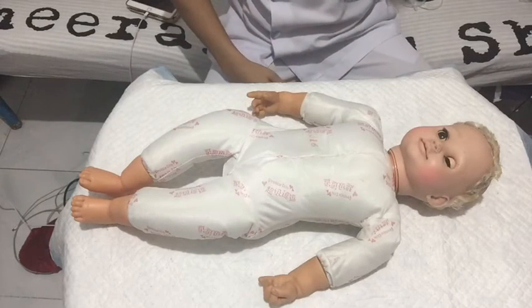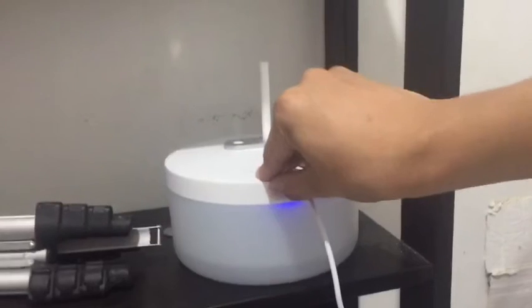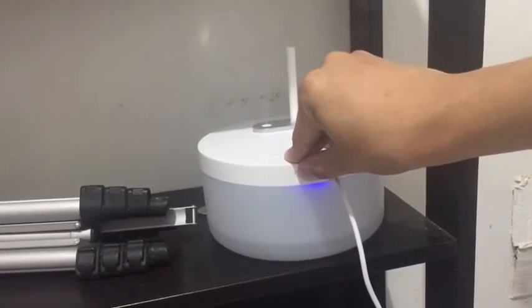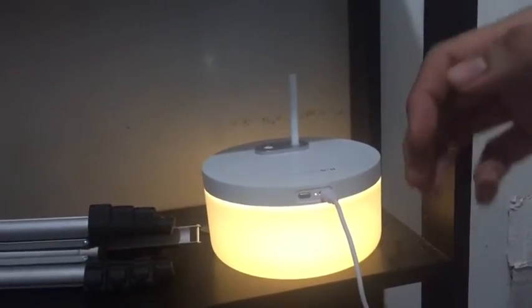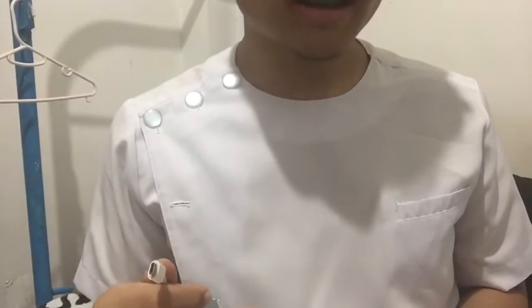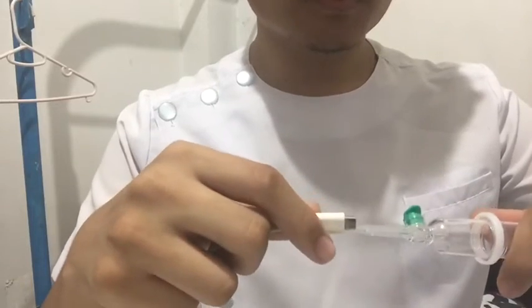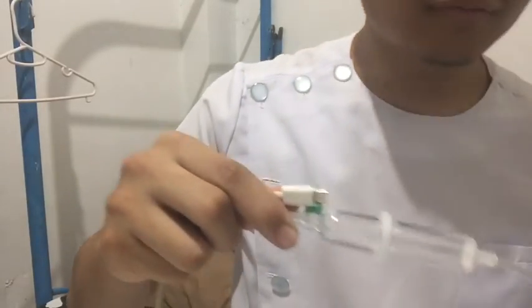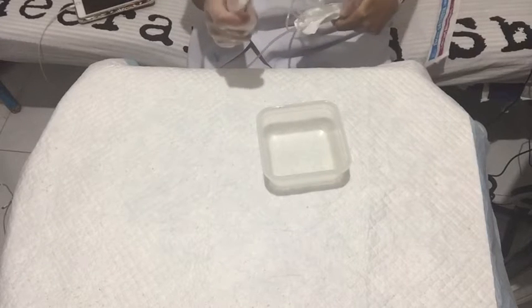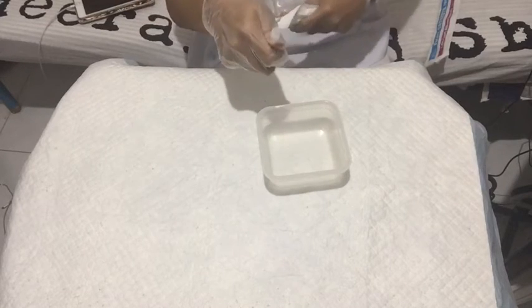Now, we're going to turn the suction device on and, at the same time, set the vacuum regulator to the appropriate negative pressure. It's either medium or moderate. Next, we're going to attach the suctioning catheter to the tubing while it remains in its package. As you can see, it's still in its sterile field. Now we're going to expose the suction catheter enough to allow the dominant hand to grab the sterile catheter.